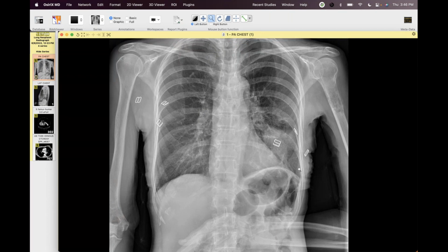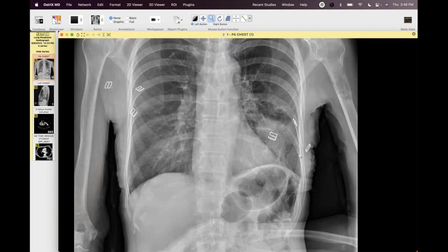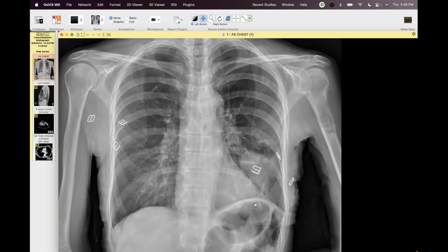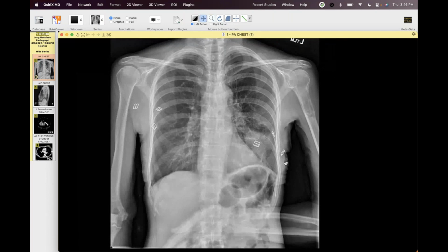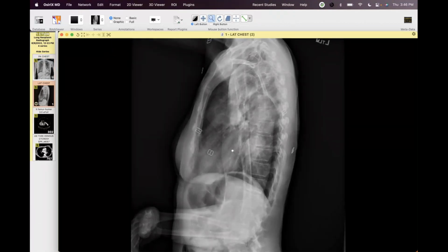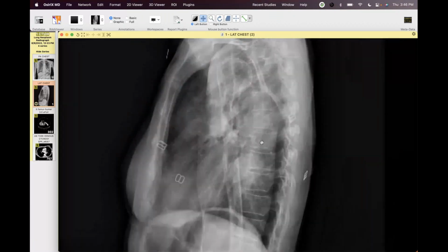Yeah, those are both the relevant findings. This is the presenting chest radiograph of this patient, and I think it's a good reminder of satisfaction of search. You see something that could be a lung cancer. I always tell residents, if somebody can't raise their arm, then you need to take another look and make sure the shoulder's not dislocated or you don't have some big metastatic lesion or fracture in the arm that's prohibiting its movement.